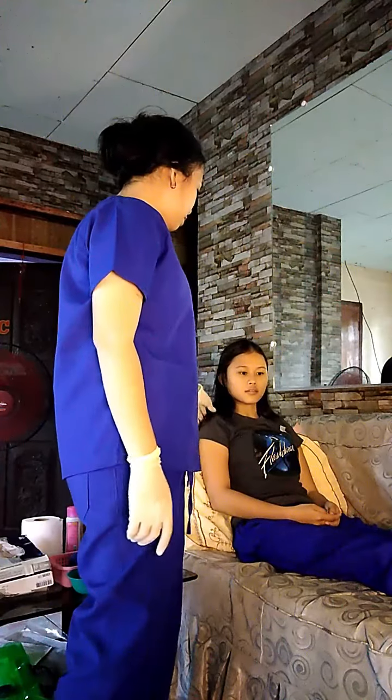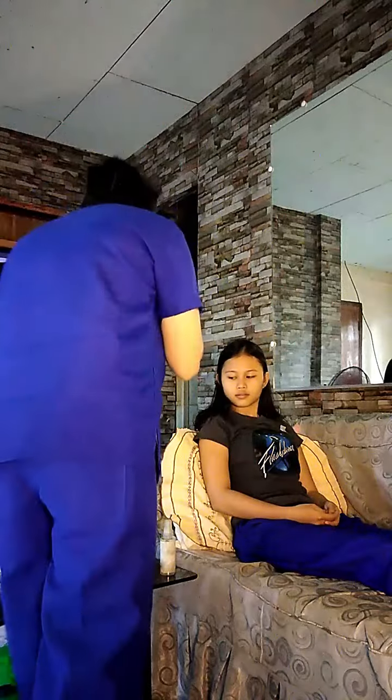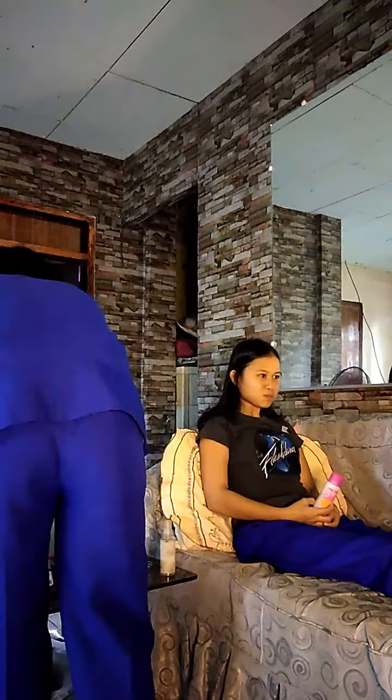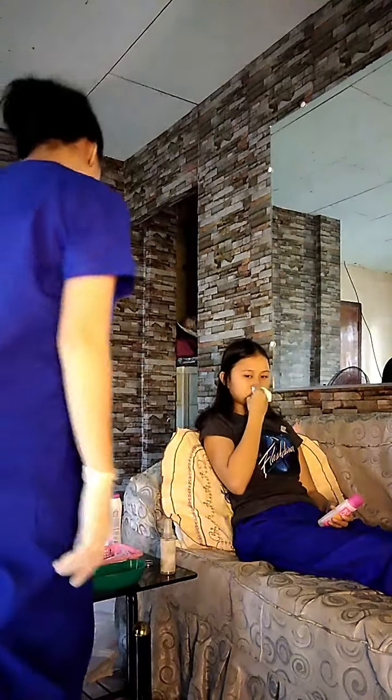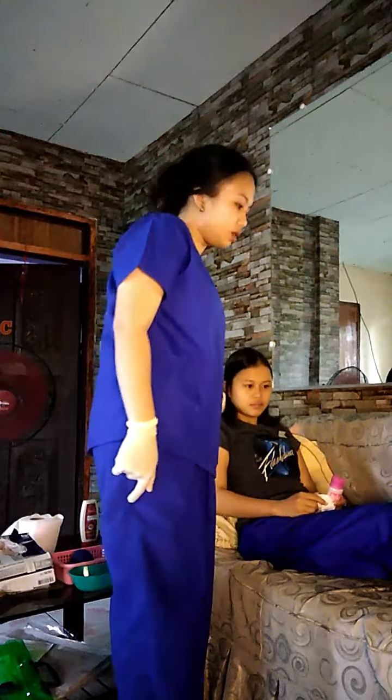And then I will give the patient oral hygiene. You can gargle using this, ma'am. And then with this tissue, you can blow through your mouth and your nose. Thank you so much. And then after we dispose of the equipment, I will position the patient to a proper position. So, are you feeling okay, ma'am? Do you feel any discomfort?